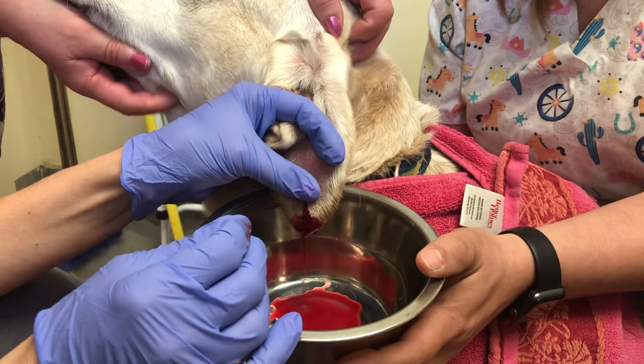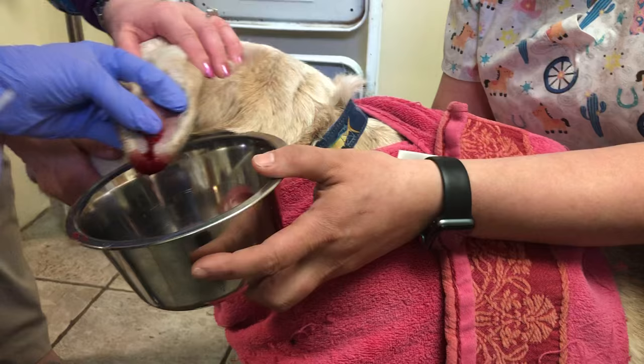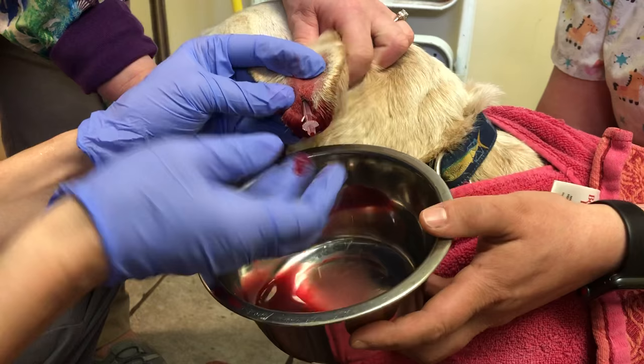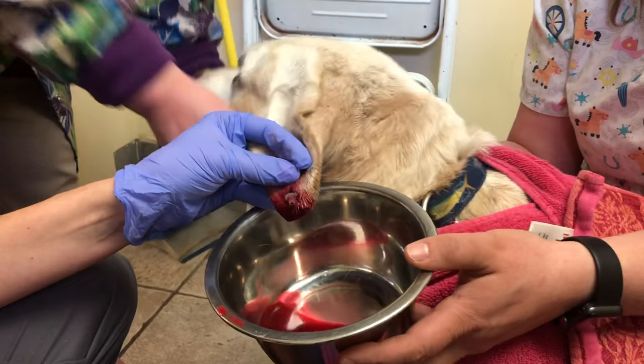I'm going to get out all the blood that's in there, which will relieve her discomfort. Then we use a teat cannula, which actually came from cow medicine. It's a drain with a little hole in it. I'm going to put that in the hole I made. It has little spikes on it which keep the teat cannula in place — you push it into the ear so the spikes are in. You really want to make sure you place it at the most gravity-dependent spot. If you've got a dog with erect ears or a cat, this probably won't work.